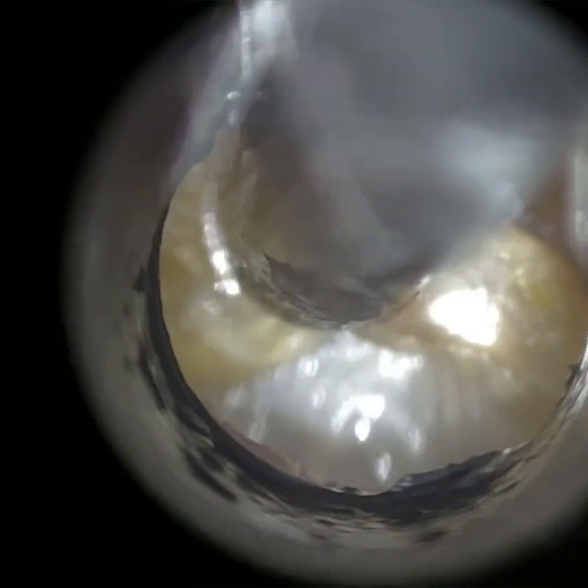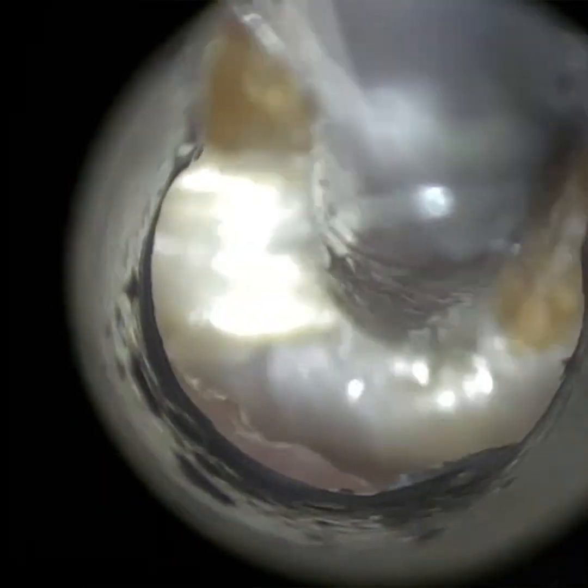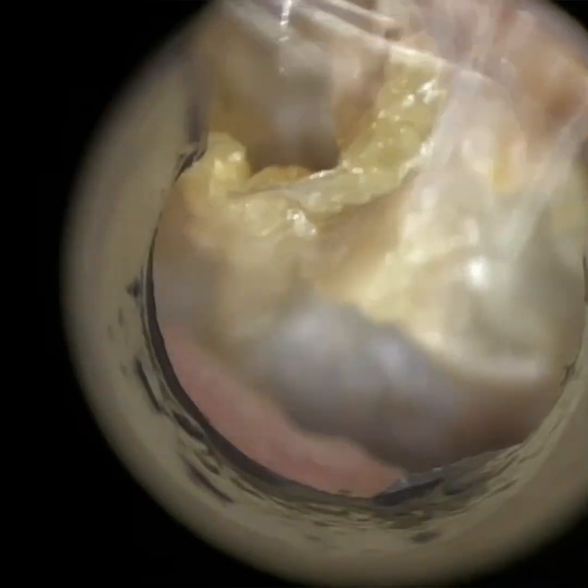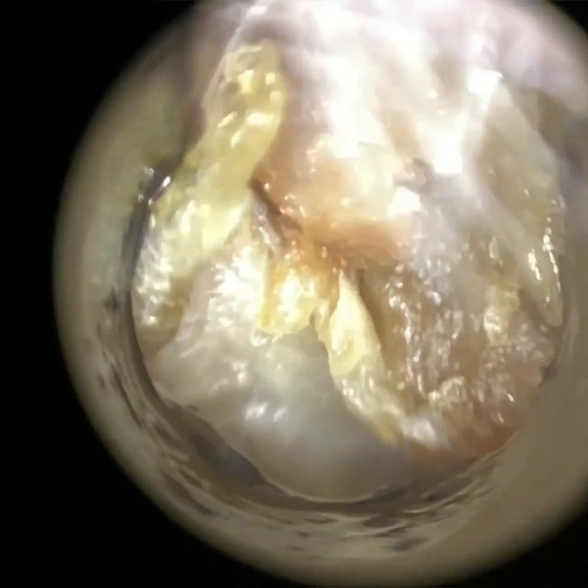The reason why I developed the Waxcope is as the next best alternative to the endoscope. In my opinion, there's nothing better than an endoscope to remove earwax, because of the field of view it provides — a wide, panoramic field of view. It's like you're inside the ear canal yourself, which enables increased manoeuvrability and visibility inside the ear.